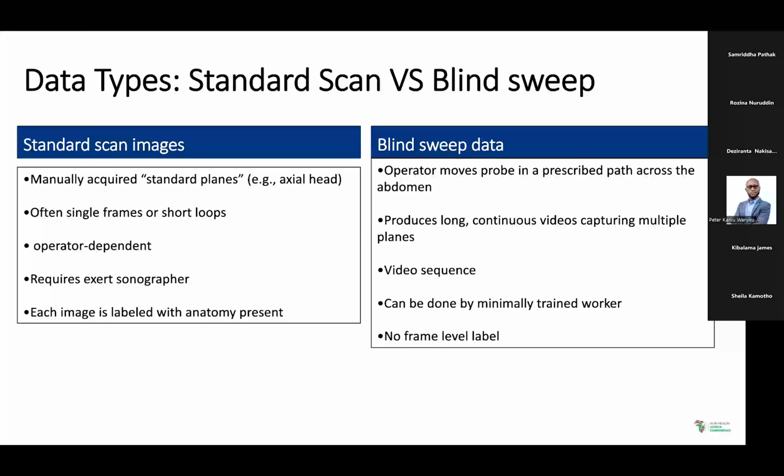Oh, but I can read for you one of the comments. Okay. Yes, there was a comment that somebody said they love the blind sweep model. It would make life really easy. And yes, I agree. Considering that's what you're doing, it does make life easy. We get nurses who are able to do the sweeps, non-expert midwives.